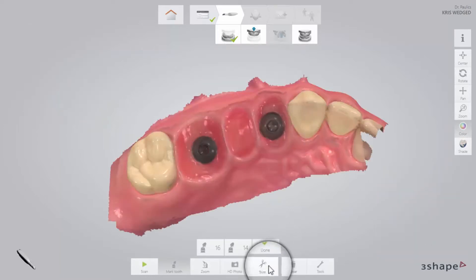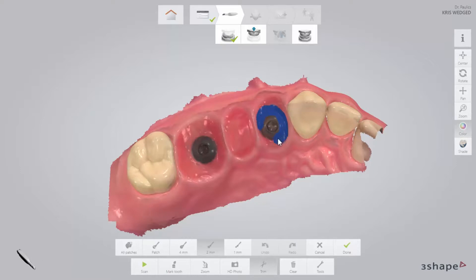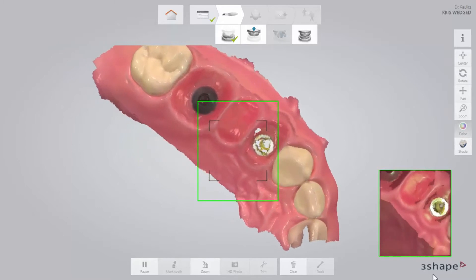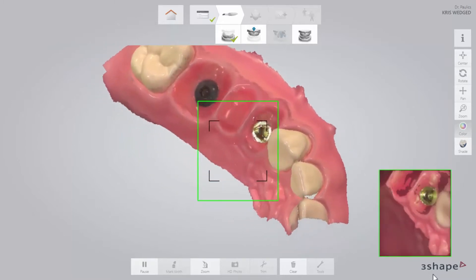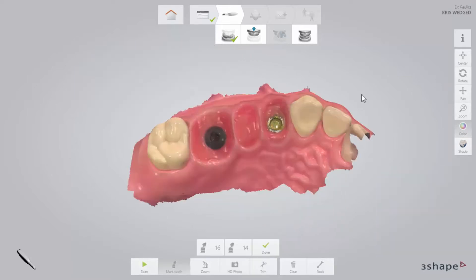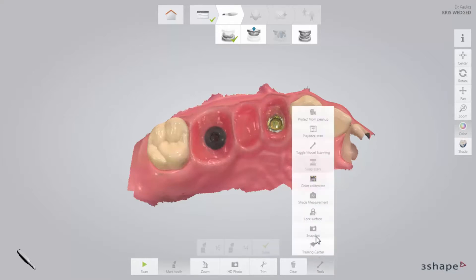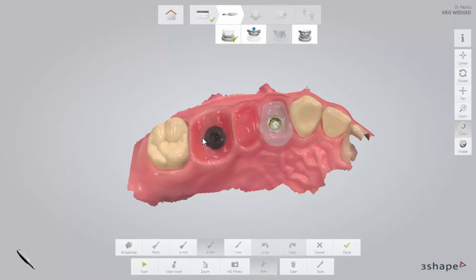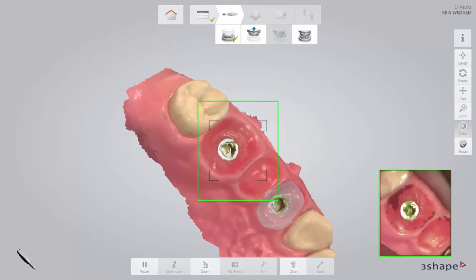Then trim away the first healing cap in the scan. Remove the first healing cap, dry the area and scan the emergence profile immediately before the gingiva collapses. Start scanning on the neighbouring tooth before moving on to scan the emergence profile. Then paint the area of the emergence profile using the lock tool found under the tools button. This will freeze the emergence profile in its current retracted state, thus preventing it from being updated with later data when gingiva might be collapsed. Repeat this procedure for all implants. Make sure also to cover the contact points in this scan.